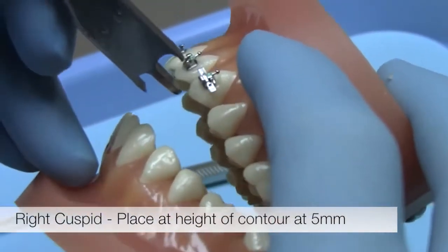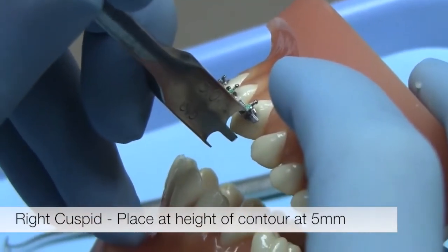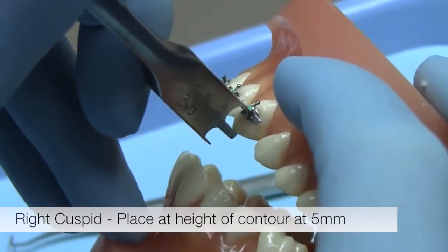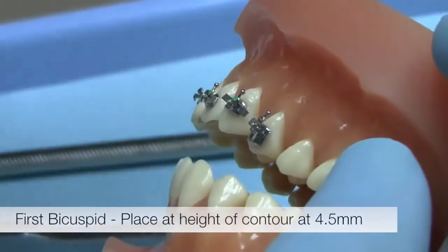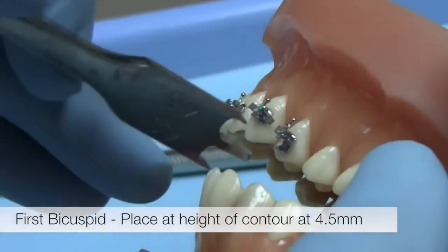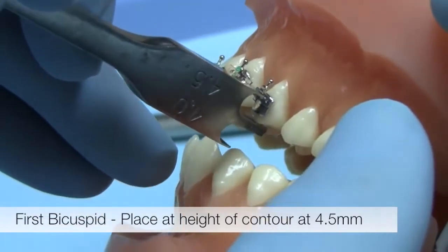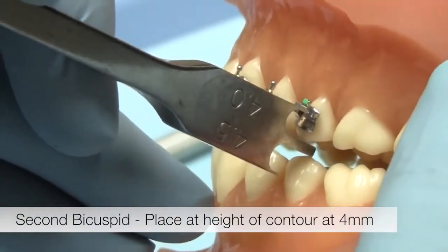So, we place it not at the center of the tooth, but at the height of contour. Make sure it's parallel to the long axis and is at a height of 5 millimeters. Now we place the first bicuspid bracket, which is also a single bracket with wings. Again, it is placed at the height of contour at 4.5 millimeters. The second bicuspid bracket is placed at 4 millimeters.